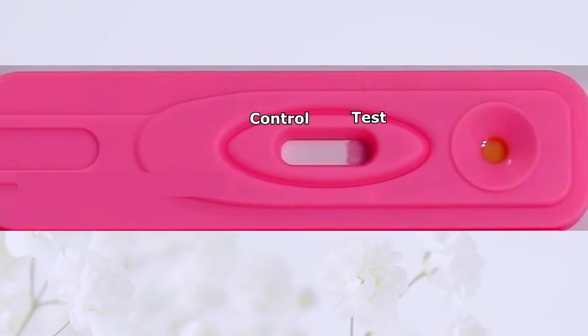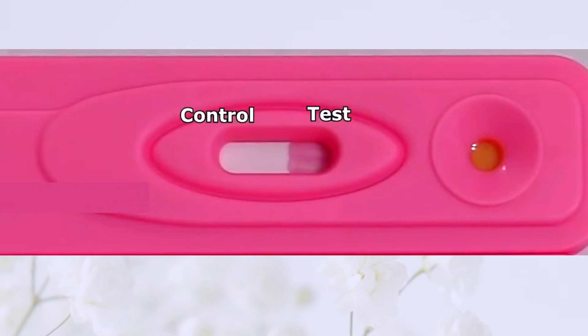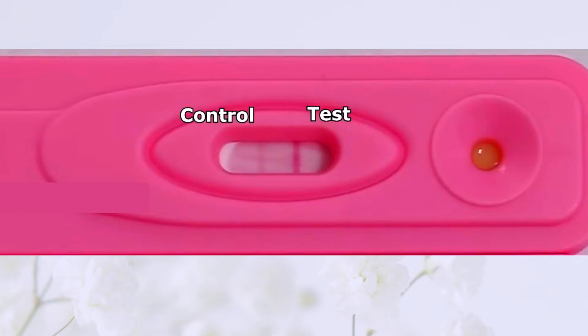What is the pregnancy test checking for? When you're pregnant, your body starts making a special hormone called HCG. The test checks for this signal in your urine. If the test finds the signal, it means you might be pregnant. This signal gets stronger as the days go by, and that's why timing is important when you take the test.